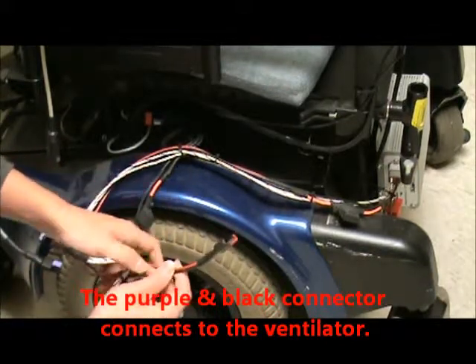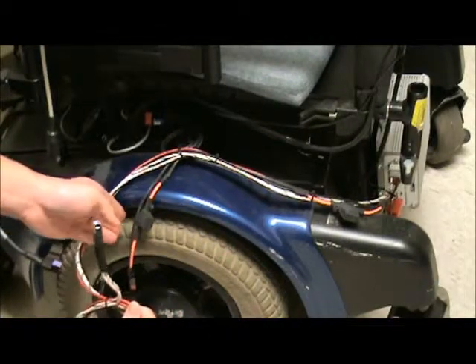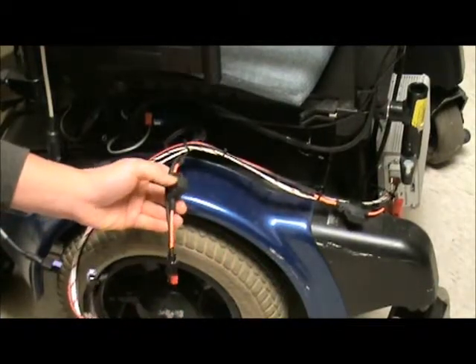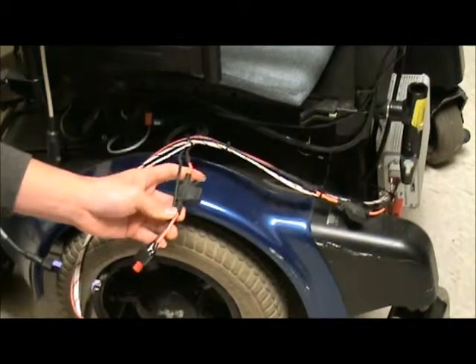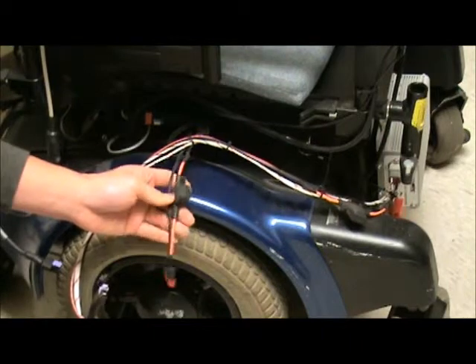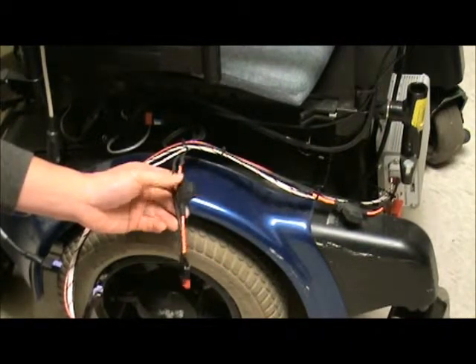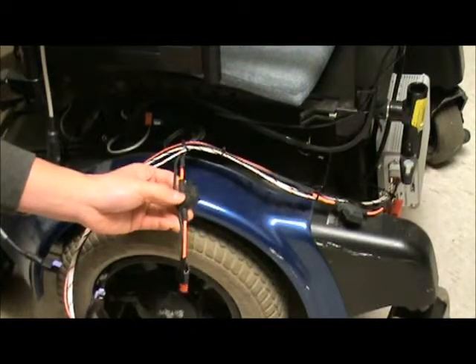On that black and red wire, we usually have a 10 amp inline fuse that we put in for protection for the machine. In case something happens, you might want to check the fuse. If the fuse is blown, you need to call us.